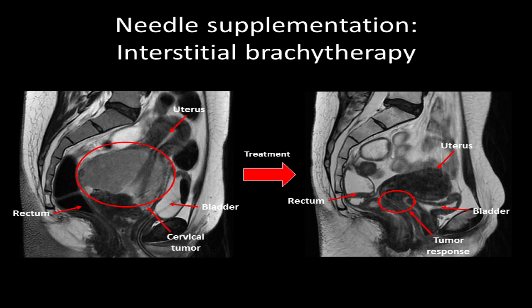Sometimes each treatment requires a device insertion. In other cases, a single or several implantations are performed, and you may be hospitalized during this process. Your radiation oncologist will review the specifics with you regarding this type of treatment, often referred to as interstitial brachytherapy.